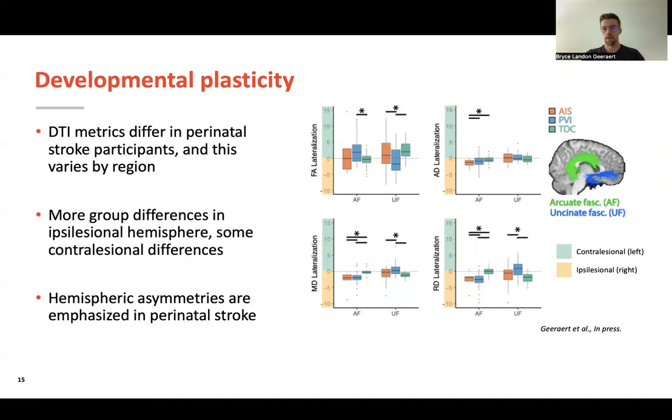And that makes sense, right? Say you have an arcuate fasciculus that's been disrupted by a major lesion. The remaining fibers, there's going to be fewer fibers, most likely. They're going to be disrupted. Their structure is going to be compromised. That's the word, compromised, by the presence of a lesion. But like I mentioned, even remote tracts that are not close to the lesion can be affected.